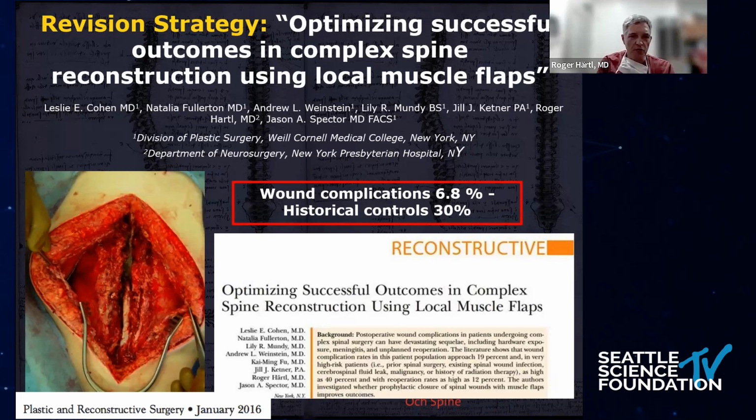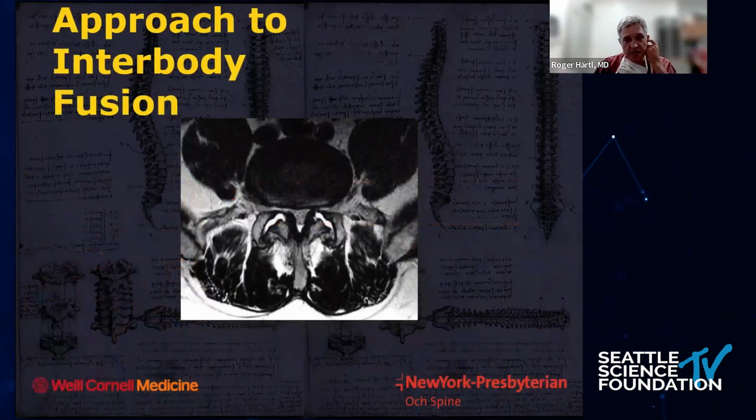Obviously, if you go back through a tube, there's nothing the plastic surgeon can do. But if you really have a hard time closing a leak and you make the incision bigger, then the plastic surgeon can allow you to put the muscle flaps down and get rid of the dead space.